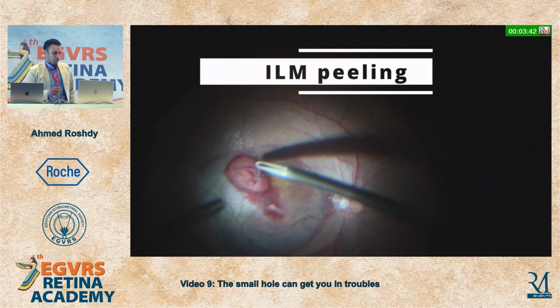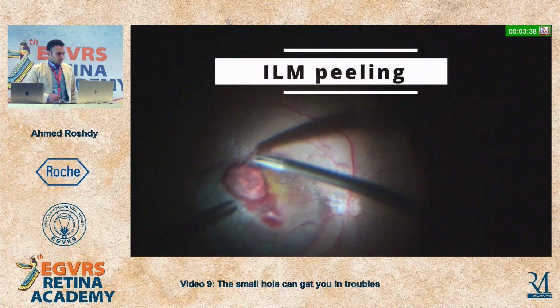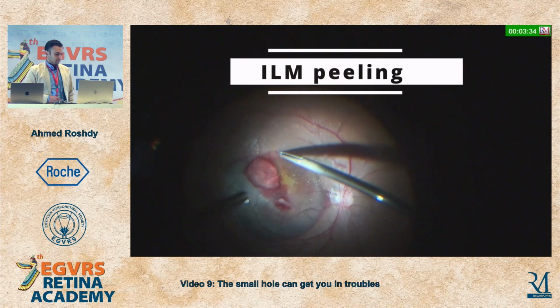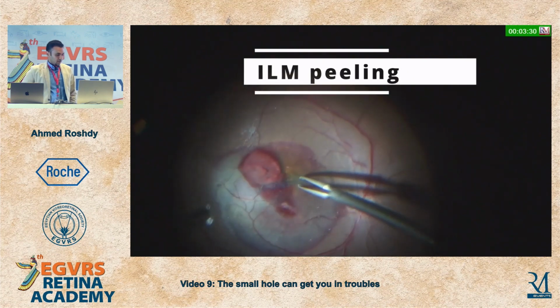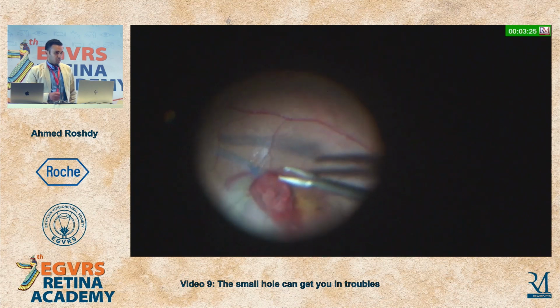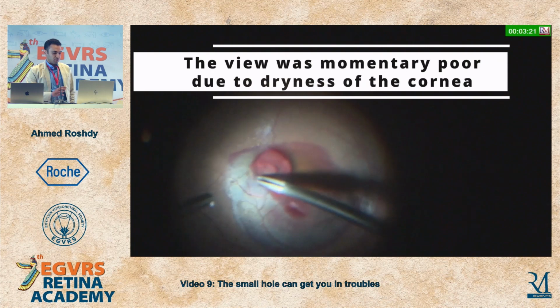I started by doing ILM peeling. But while I'm doing ILM peeling, the view got momentarily poor due to dryness of the cornea.